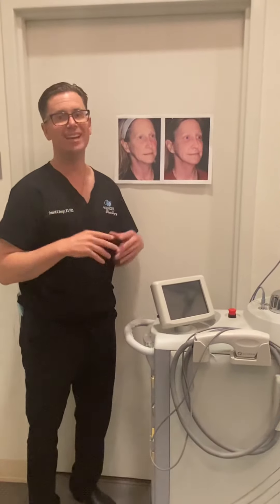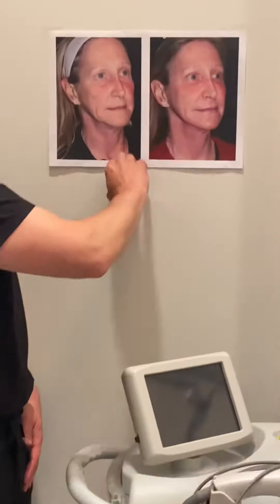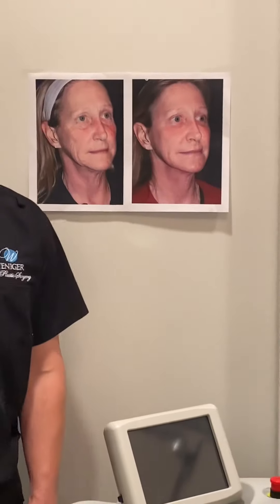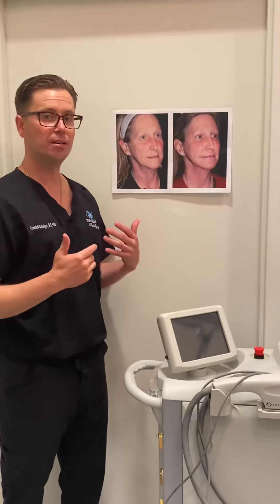The downside of laser resurfacing aggressively like that is the redness lasts for a long time. Here we see at six weeks she still has redness around her eyes. But it's a pretty cool improvement that you can do with just laser and fat grafting.